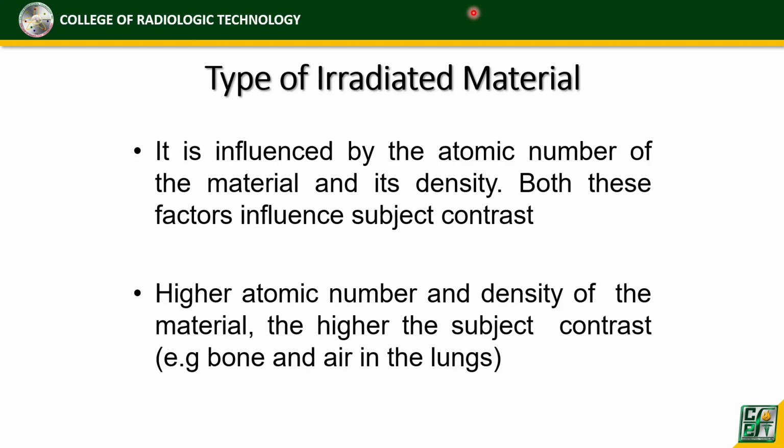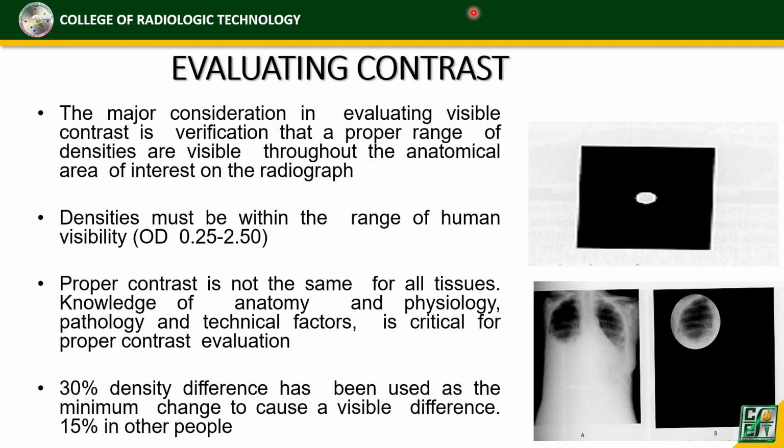Anyhow, so again, irradiated material and the subject contrast is directly proportional. So the higher the atomic number or the density of the material, the higher the subject contrast. Okay? So when evaluating contrast, the major consideration should be the visible contrast. Okay?